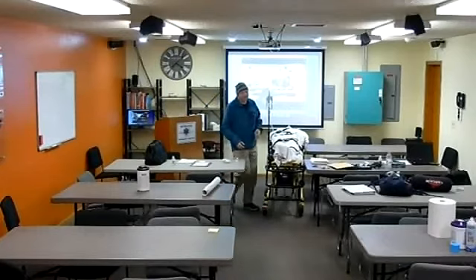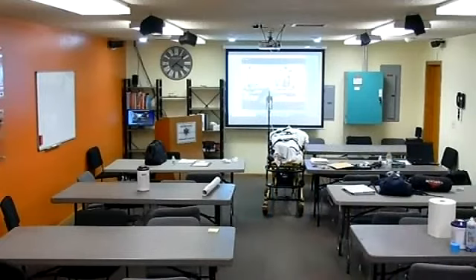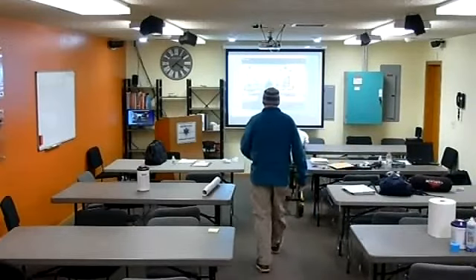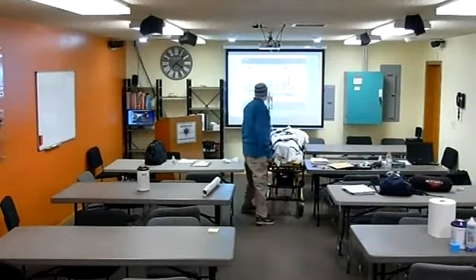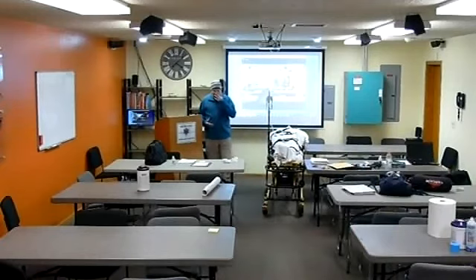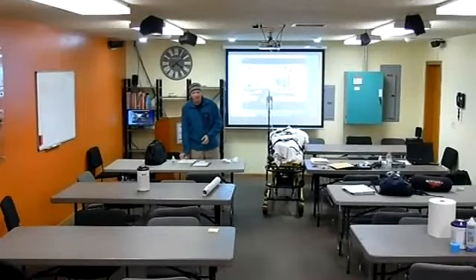My name is Christopher South, and I am the Education Coordinator here at Metro Area Ambulance in Bismarck, North Dakota. Today we're going to be going over the state-approved IV course. This course is designed for the EMT to be able to maintain IV medications, all right? What this course does not authorize you to do is certainly not to place an IV. It does not authorize you to insert an IV.